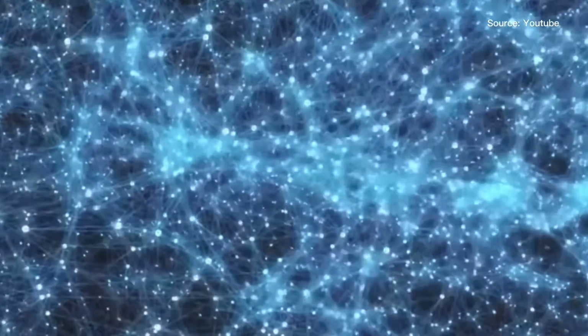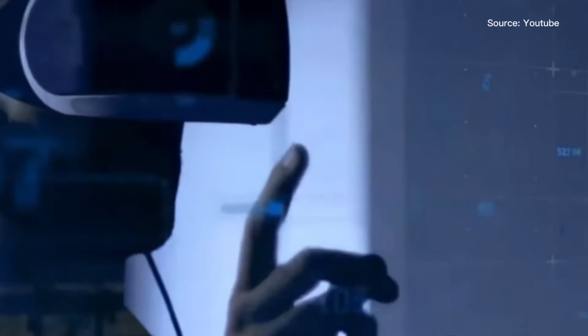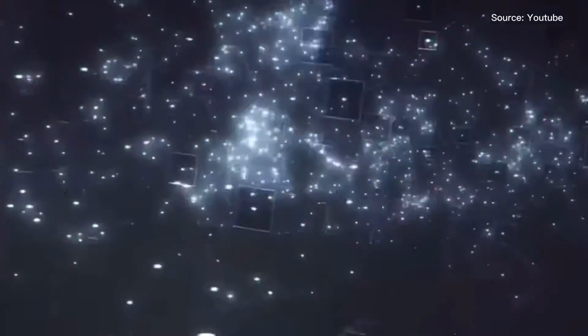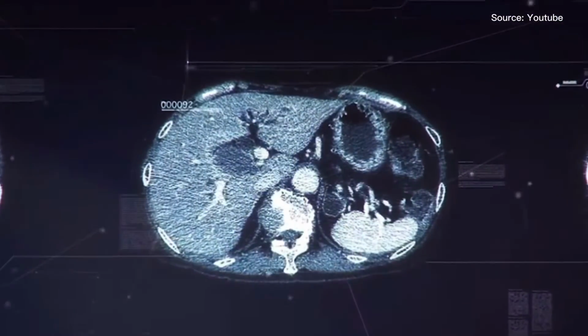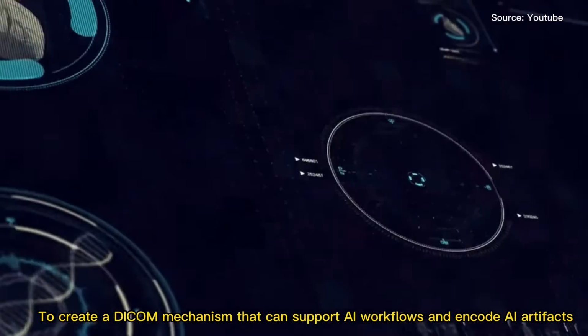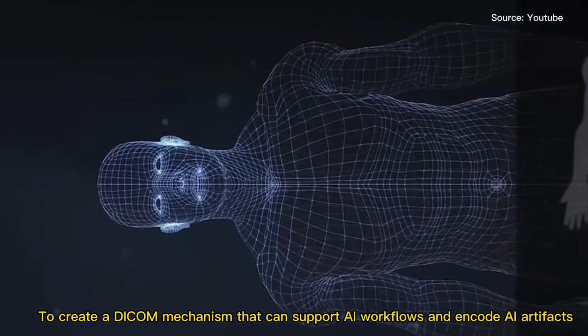As AI image classifiers become more popular in medical imaging, the Dicom standard is being updated to support AI-specific content. A special AI working group is part of the Dicom Standards Committee. This working group's mission is to create a Dicom mechanism that can support AI workflows and encode AI artifacts.